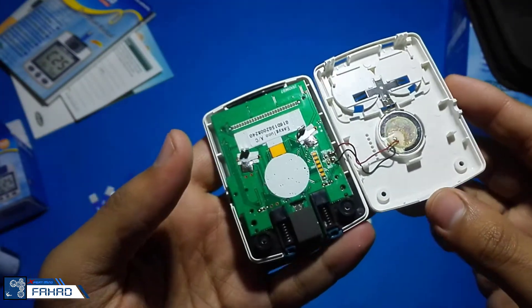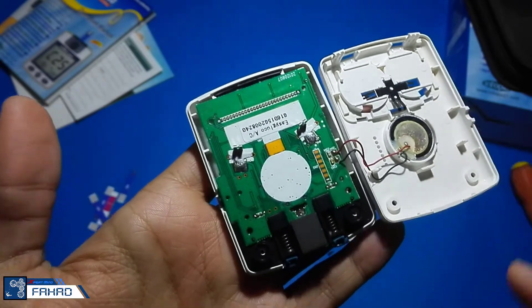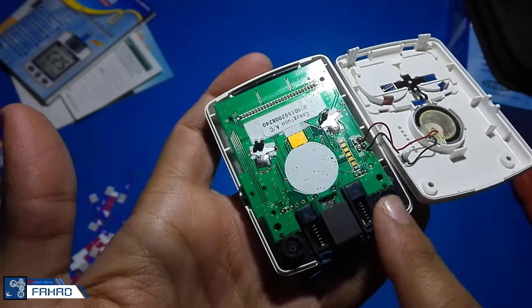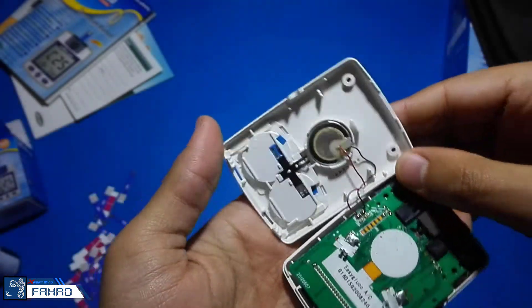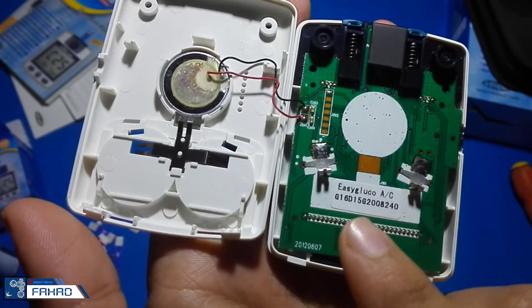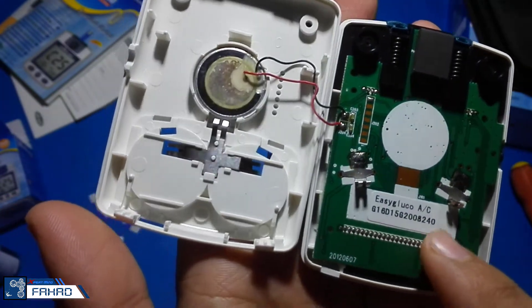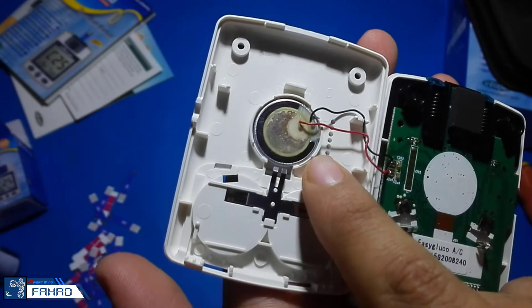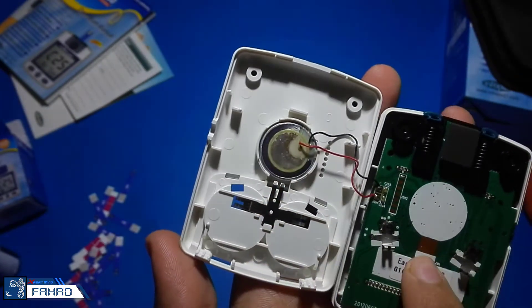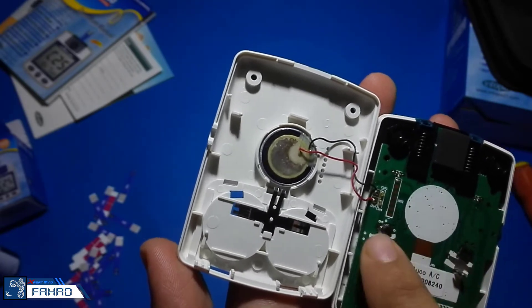Now I am going to remove the back cover. Now you can see the board of this glucose meter — there is nothing much complex, it seems to be simple. Here it says Easy Glucose and below that is the serial number. This is the speaker — a simple speaker — and these are the battery terminals which are connected to the board.